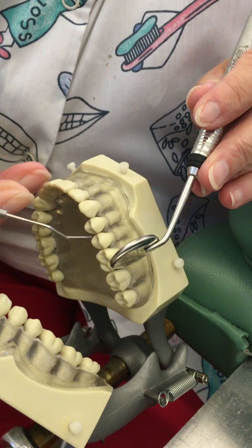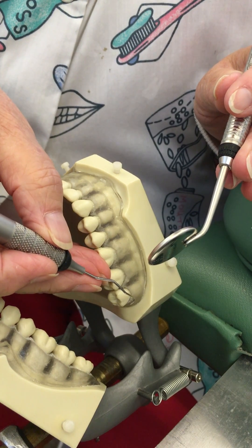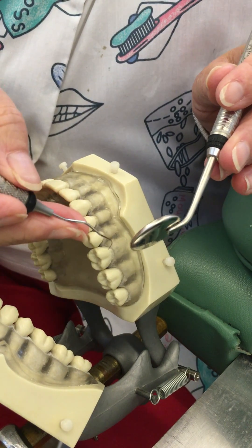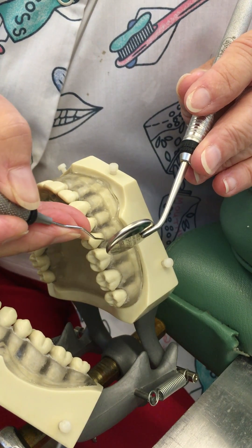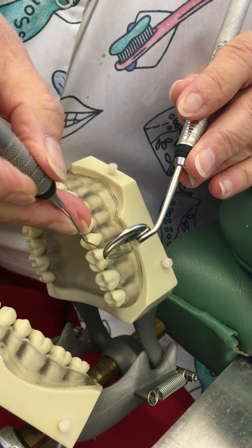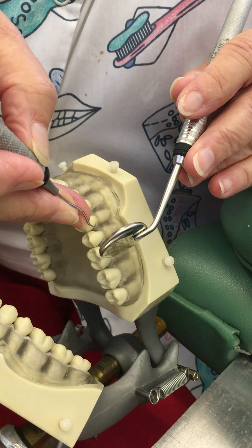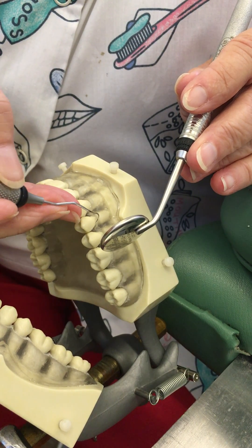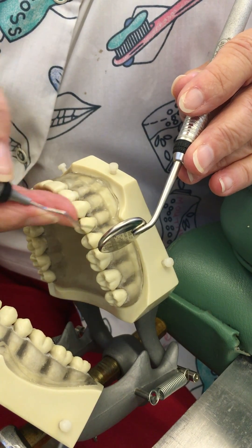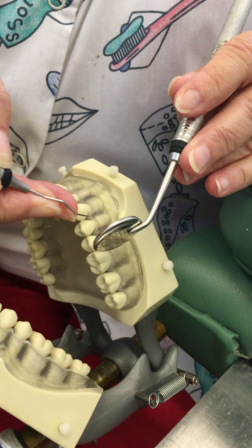When I say I'm shortening up my instrument, I'm just coming down on it. I started out with it long, and if I keep it long my fulcrum ends up being more than one to two teeth away — and you want your fulcrum as close to the working area as possible. I'm flip-flopping my eyes between my mirror and the tooth itself, integrating direct and indirect vision.